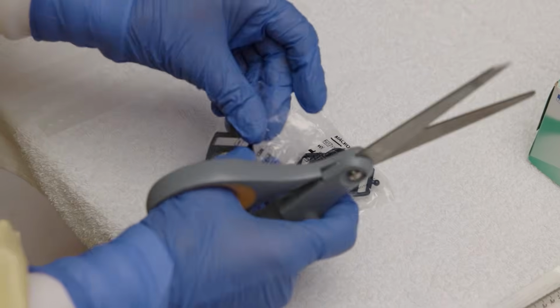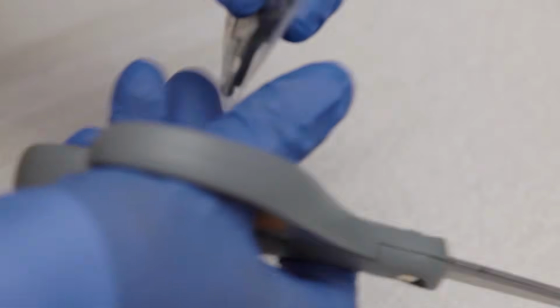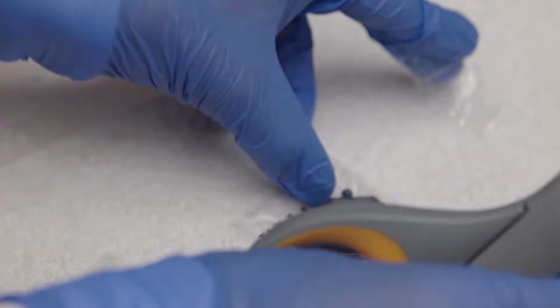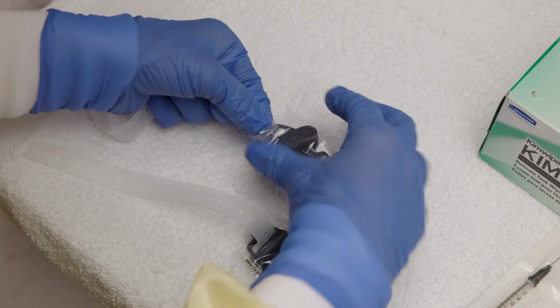To attach the strap to the collector without compromising sterility, carefully cut the end of the plastic wrapper, keeping the rest intact. Attach the strap while keeping the collector clean and protected by the wrapper until it's ready to use.